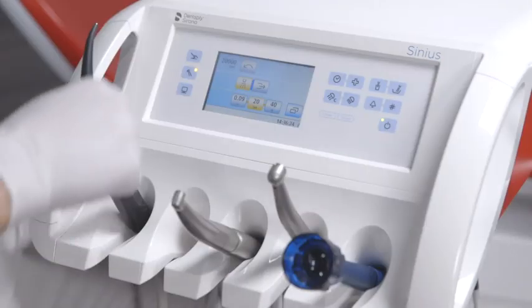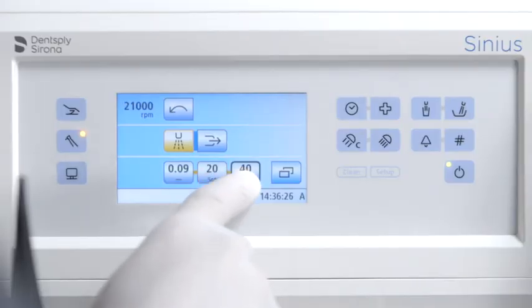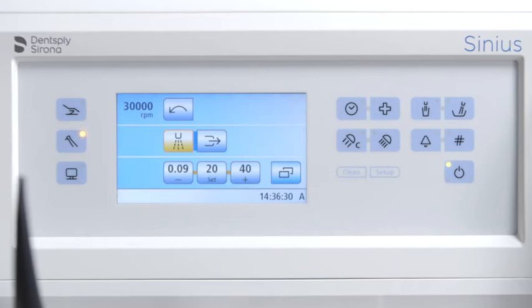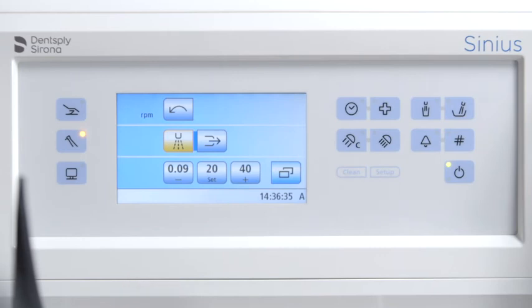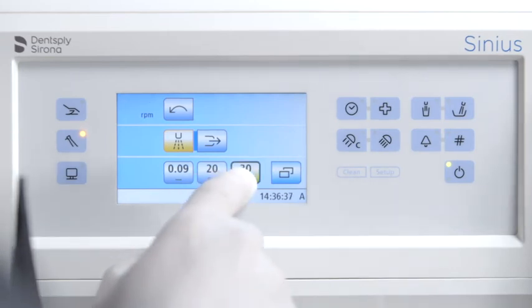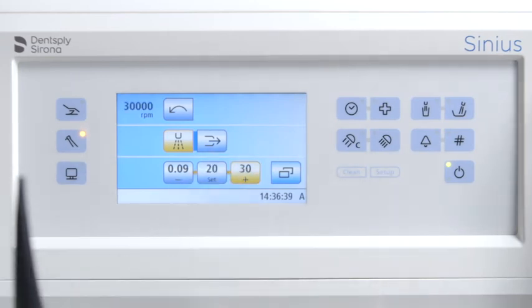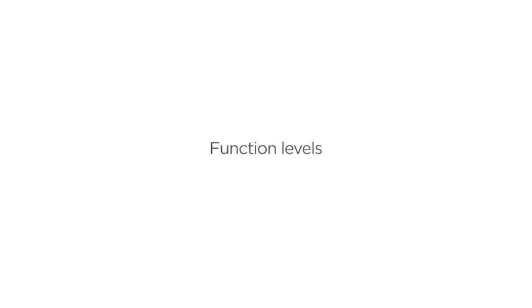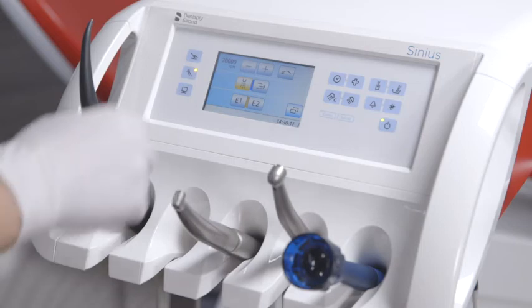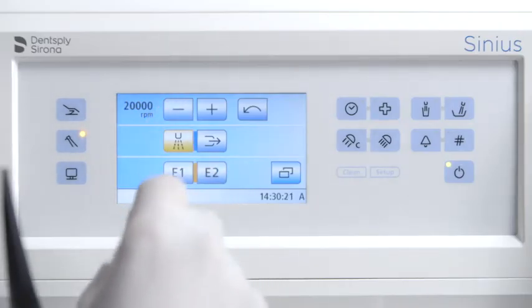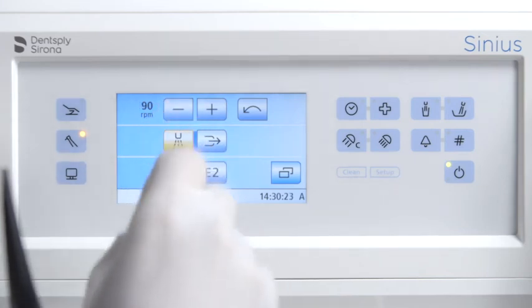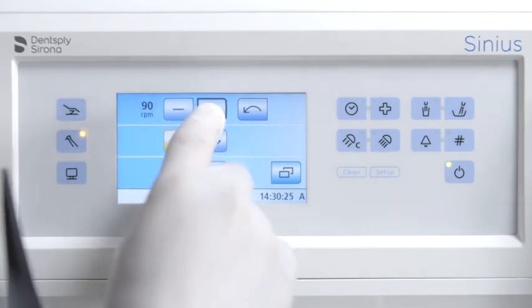The button values can be changed individually with the programmable quick setting keys. Pressing and holding the middle set quick setting key activates the programming mode and the values flash on the touch panel. Briefly pressing the plus and minus buttons adjusts the speed in larger increments. Pressing and holding the plus and minus buttons enables fine adjustments.